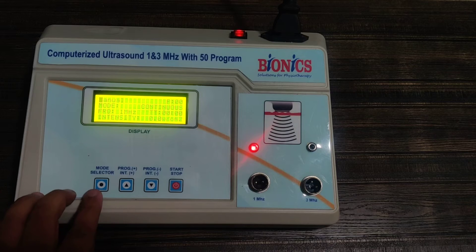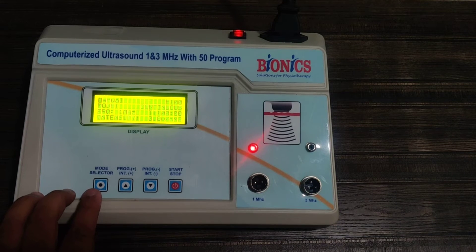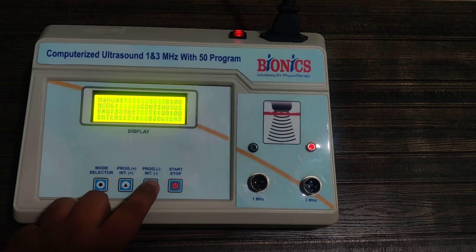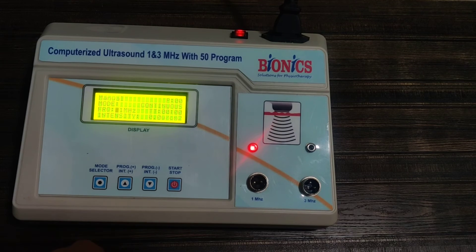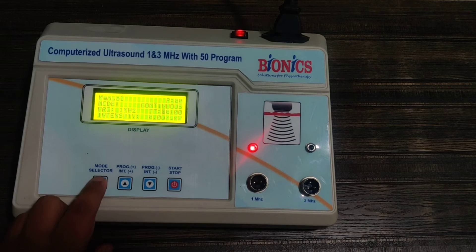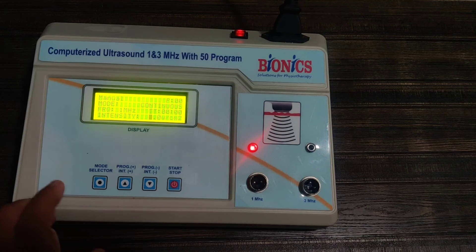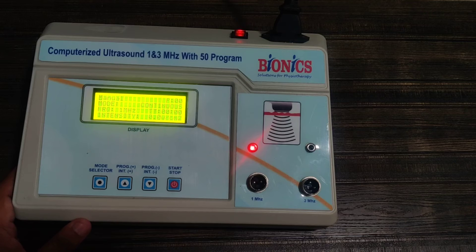In manual mode, if you want to change the settings, you can go to continuous. This is 1 megahertz — you can change it to 3 megahertz and back to 1. This way you can select the frequency, change the timer, and then change the intensity. After selecting all settings, you press the start button.